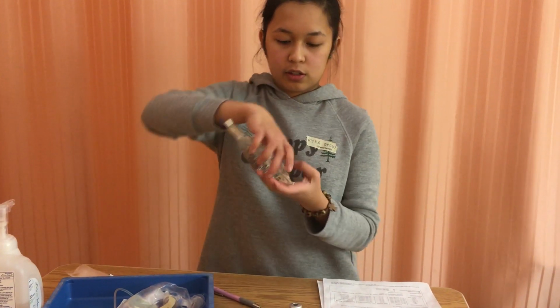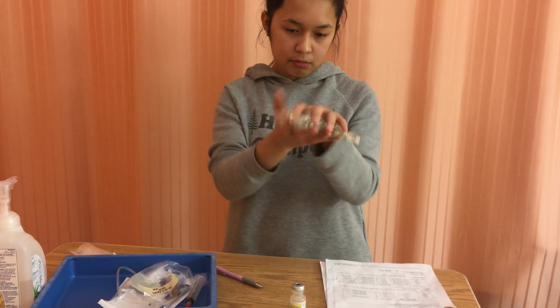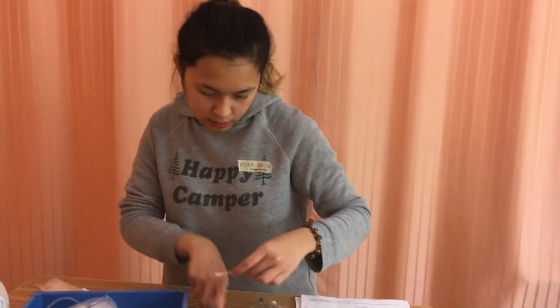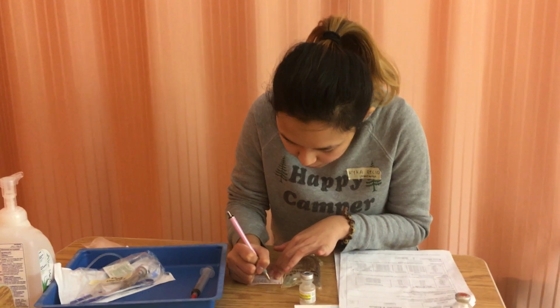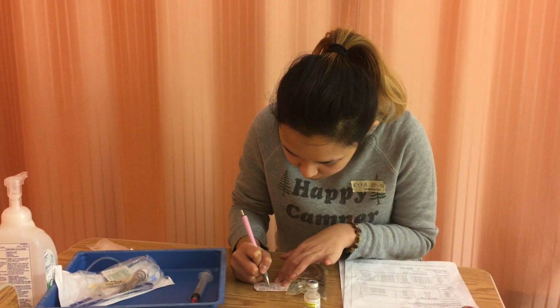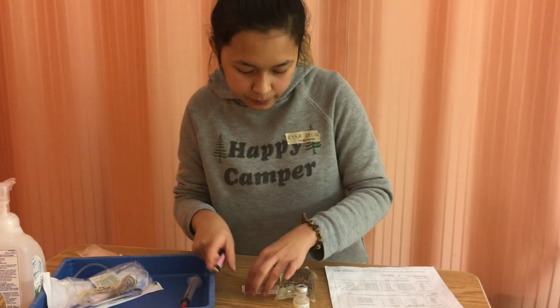So I'm going to just mix it like so, invert it. At this time, I'm going to write my label. So this is still for Regina Phalange, and this is the penicillin G sodium, 3.5 million units, 107 mils. Diluent is 100 mils. I would write the date and the time and my signature.